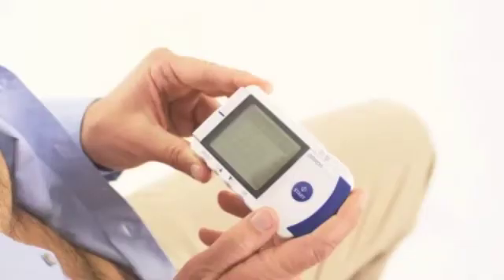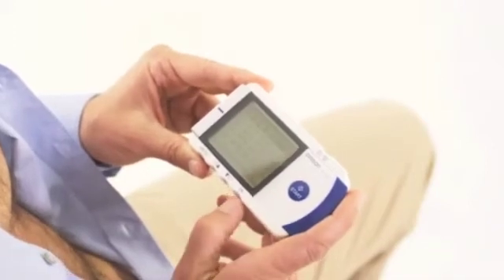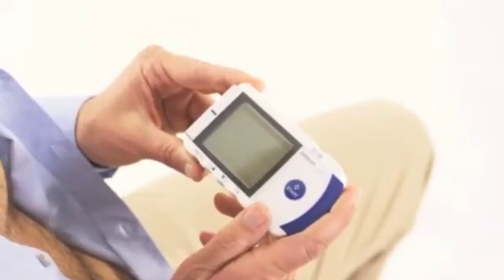Now you can read the ECG, the heart rate, and a short summary of results.